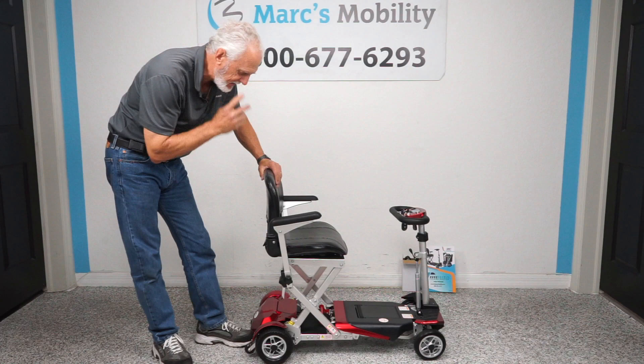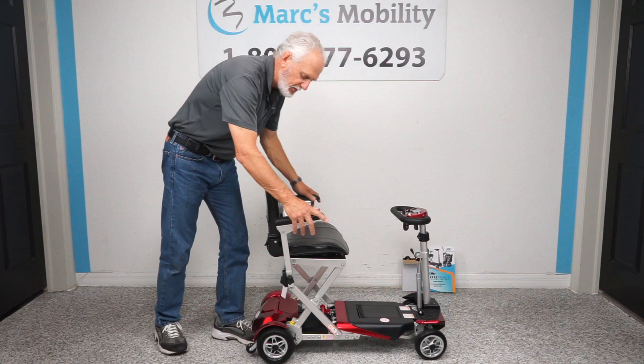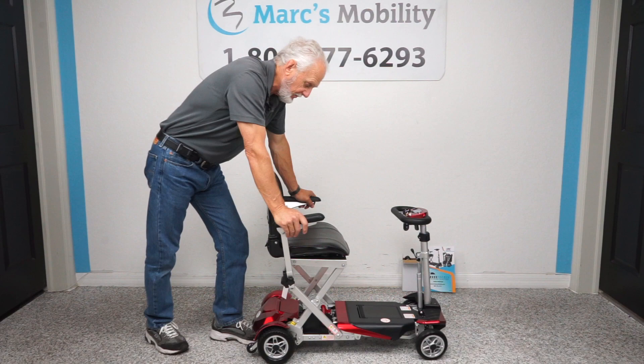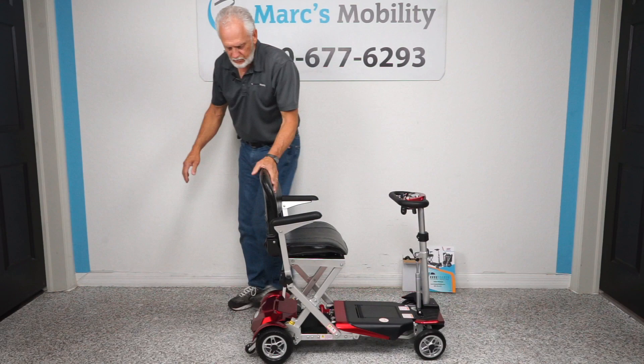So let's recap. This is the new Transformer by Enhanced Mobility — it still has a 300 pound capability. The seat is 17 wide by 14 deep. The back does fold down, the arms do fold up, and the arms can be removed if you need to remove them. The scooter is only 22 inches wide by 38 inches long. The heaviest piece on this scooter with the battery out is 55 pounds.